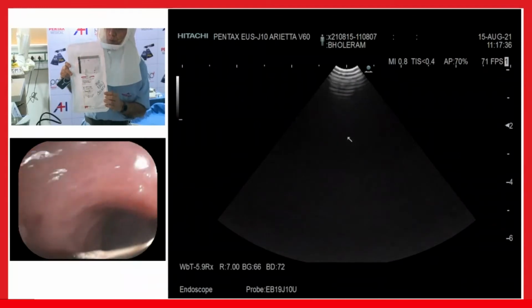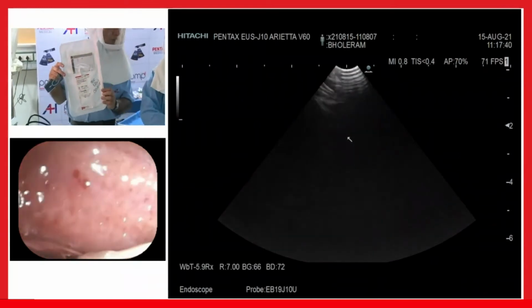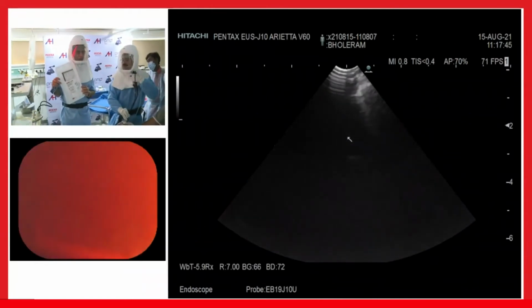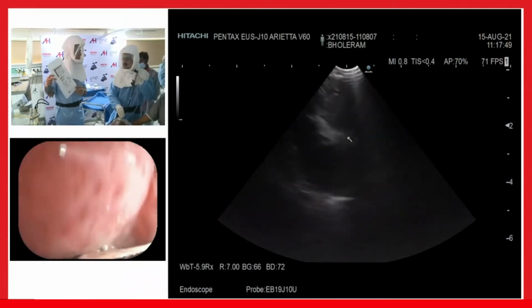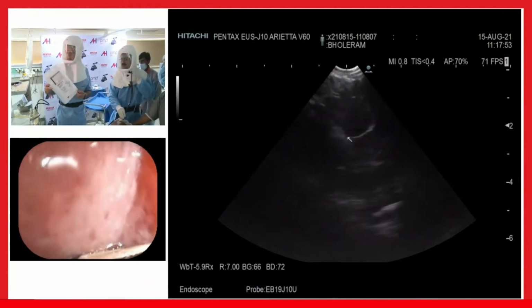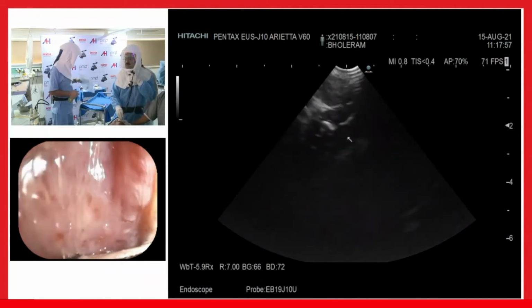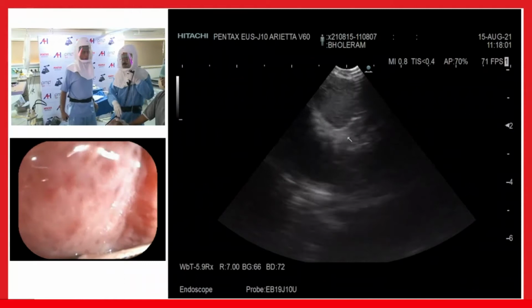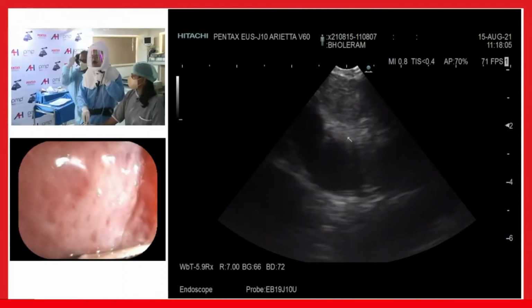For this node, because with the sampling you need to establish which type of malignancy it is. Because it is a PET positive node, in this case, instead of FNAC, we are proceeding with a Procore biopsy maybe. Okay. This is, I think, a good one. Now, hold it.